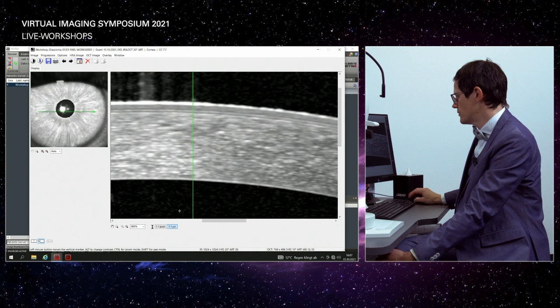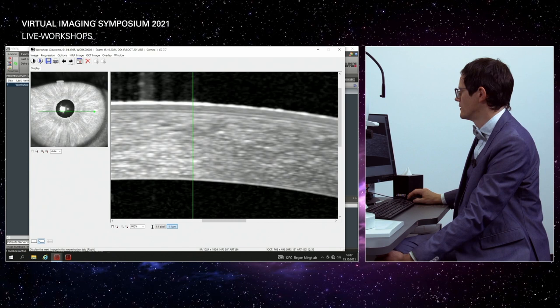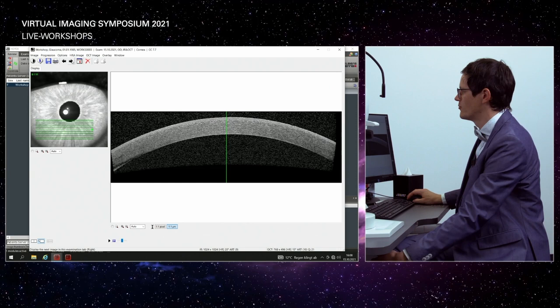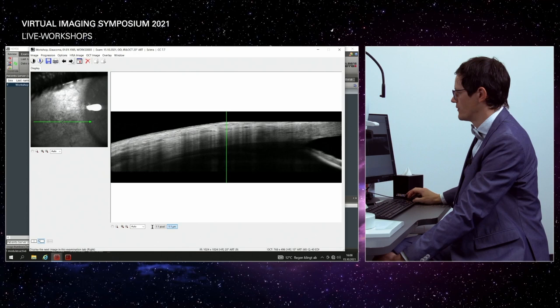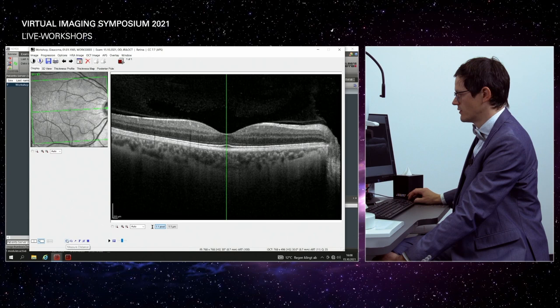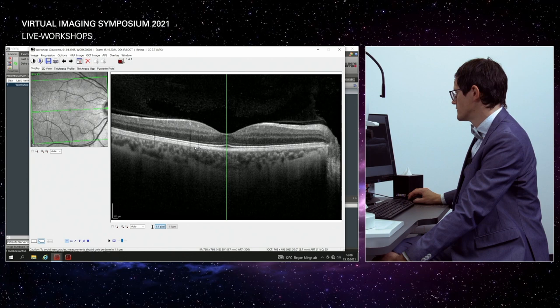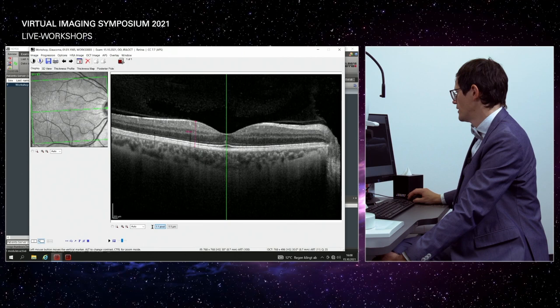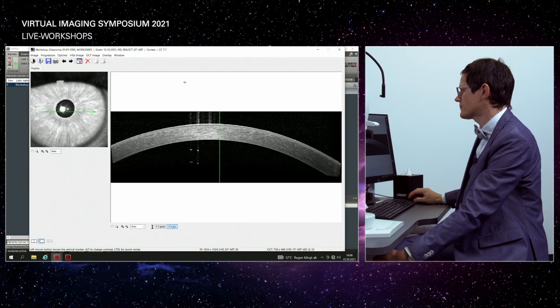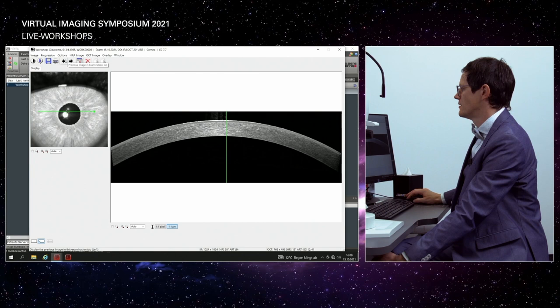The measurement tools seem unavailable in this window, but the functionality is the same as in the retina application. In the retina application the measurement tool is available — I would select the start point and the end point across the cornea thickness, and the measurement would show the value. A typical central corneal thickness would be around 550 microns. Going through all the corneal scan information, we can see the cornea appears consistent throughout.